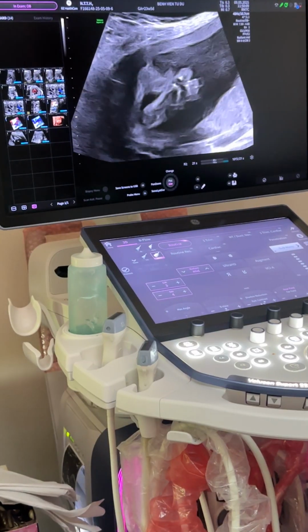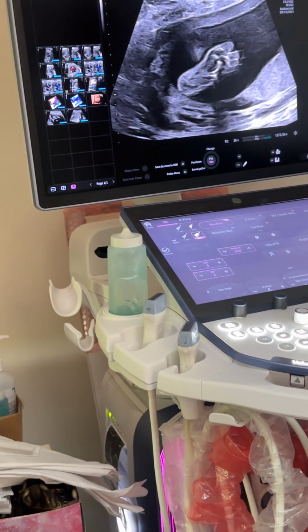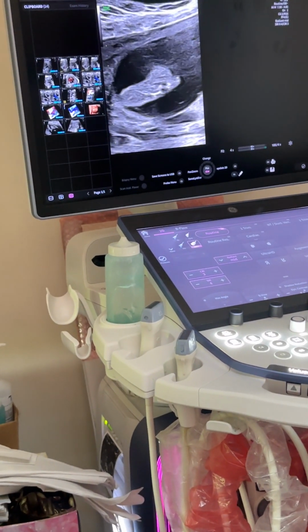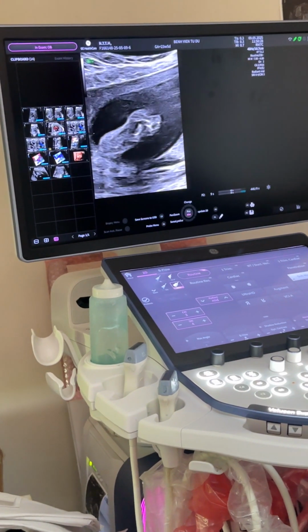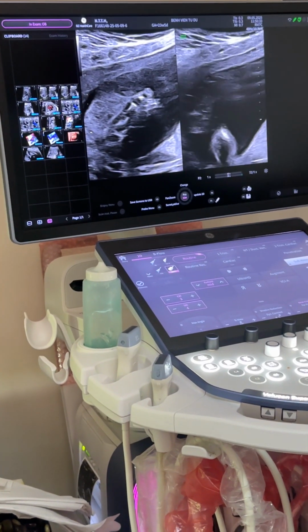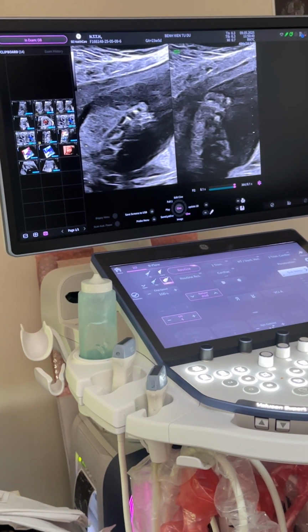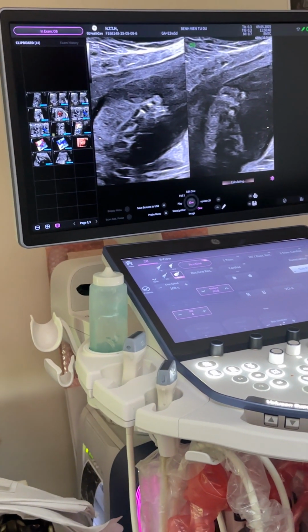It's important when you see an abnormality in the hands, ectrodactyly in the hands, to check that you don't have ectrodactyly in the feet. So if you split the image here, you can see the little toe, the next, and next. So you can see big toe, 1, 2, 3, 4. So there's a normal count of toes on that side. When you come across to look on the opposite side, you can see a normal big toe, and then you can see the other toes. So if you look at both feet, there's not oligodactyly and there's not ectrodactyly in this foot either.